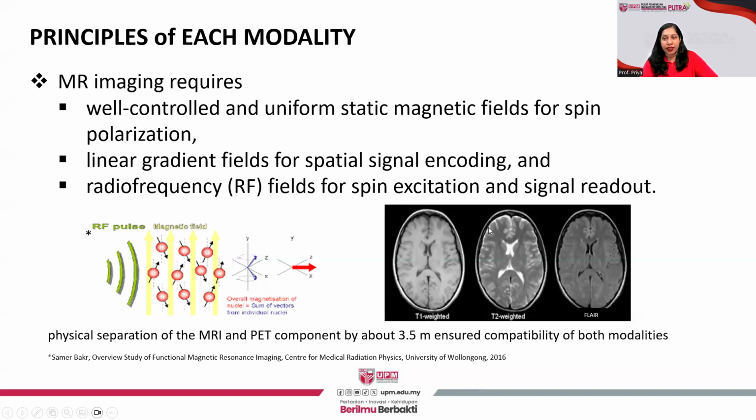As you can see, the white matter is darker, but the gray matter in the outermost part of the cortex is relatively brighter on a T2 weighted image. FLAIR is similar to a T2 weighted image, except that the water is darker. So the water is dark in FLAIR, also known as the fluid attenuated inversion recovery sequence of MRI.